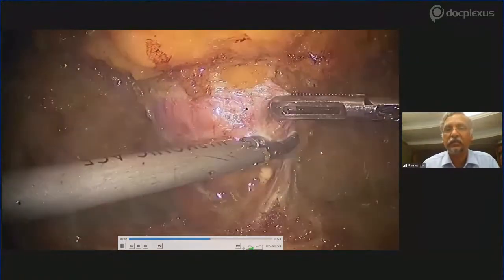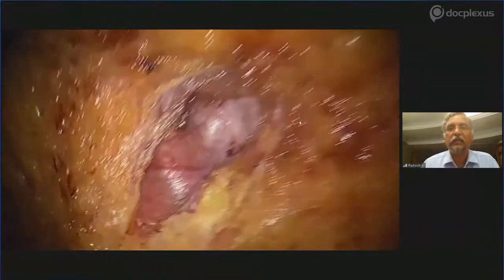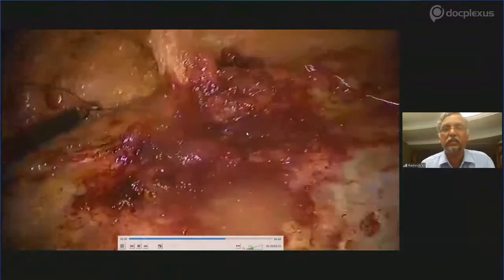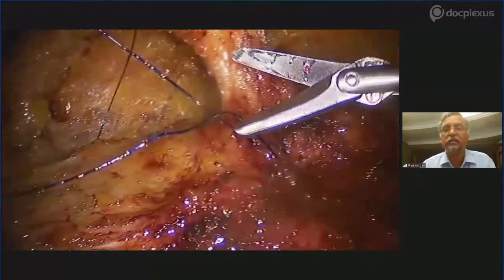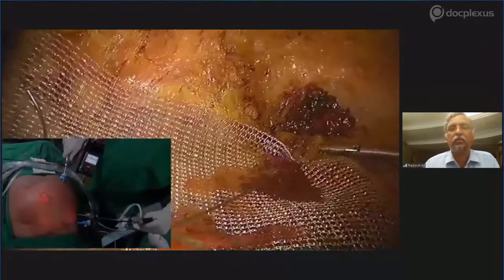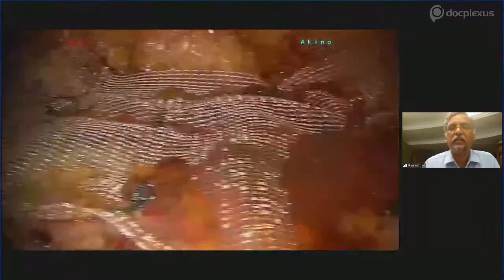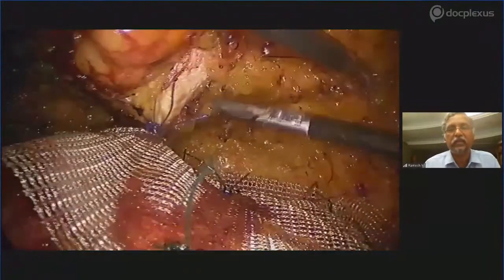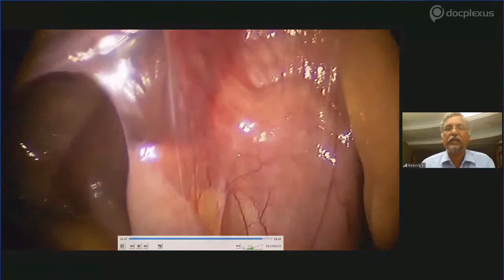As he showed, the steps are very easy and methodical, and it is very easy to do these surgeries for a primary ventral hernia of small size. As he showed, it is just like doing open surgery, quilting the mesh. The other thing that I have been doing is using a drain. Drains are kept through the two 5mm ports.